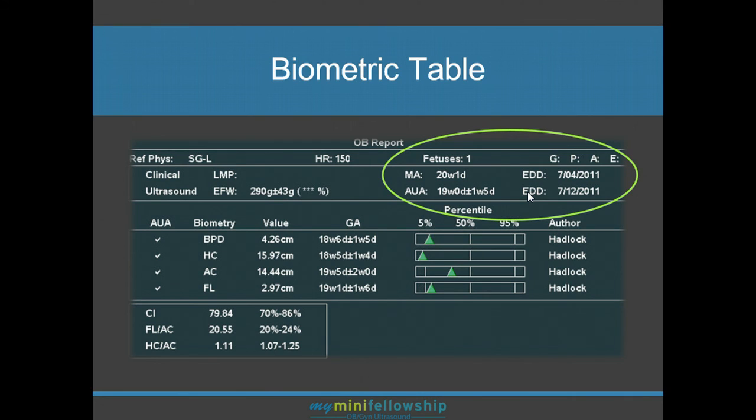Now, we could be off on our dates clinically. The baby could be small. We don't necessarily know without a previous report. Again, we're going to cover a lot more on how to interpret that and how to deal with that in our later lectures. We'll also deal with what happens when you see the femur being a little shorter. Is it really abnormal? Is it just a short mother? And at some point, we'll also cover some of these measurements, calculations, and what slight variations in this tell you and where they should point you.